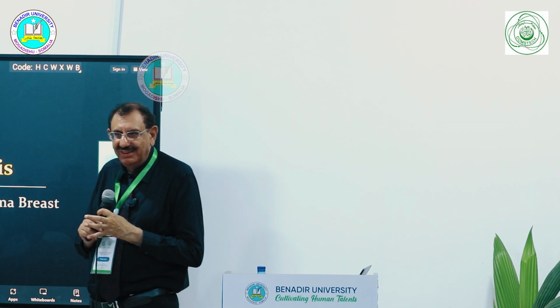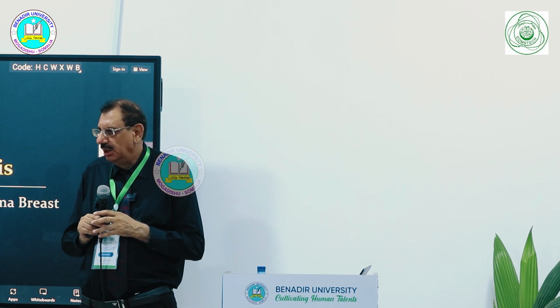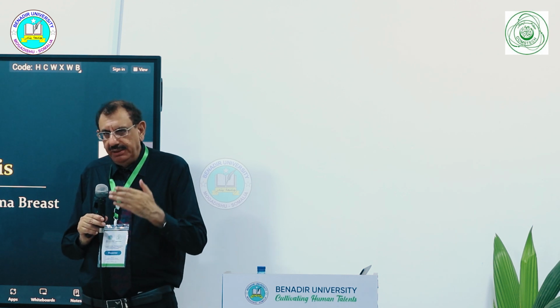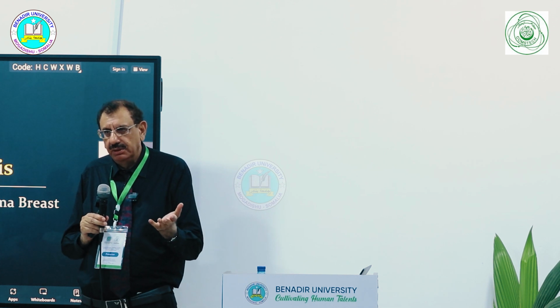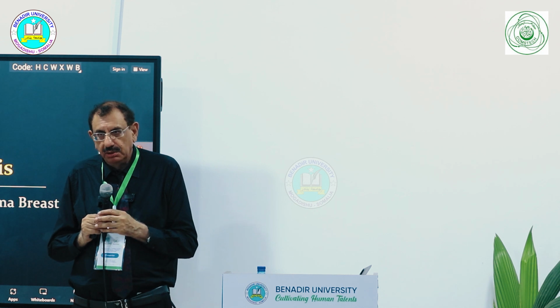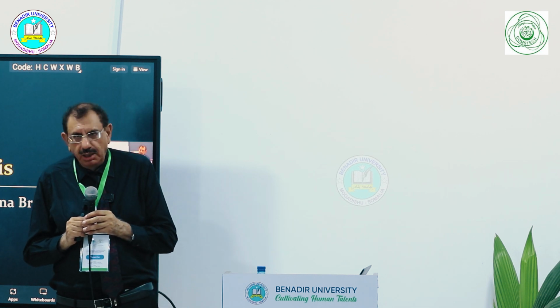So, as you rightly guessed, it was metastatic lobular, and indeed there was a history quite some time ago about the mastectomy and all that, though the reports were not available. So lobular carcinoma, again because of the E-cadherin loss, may invade easily, and stomach is one place, but even more commonly, in the endometrial lining, it may present as involving the endometrium, and obviously any organ.